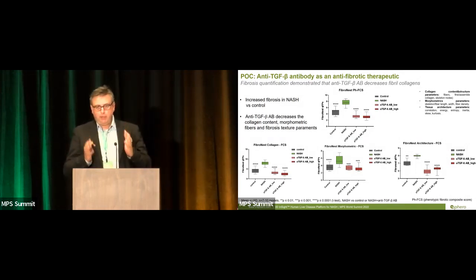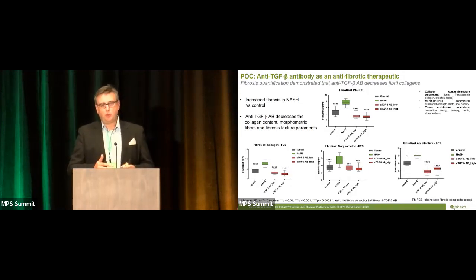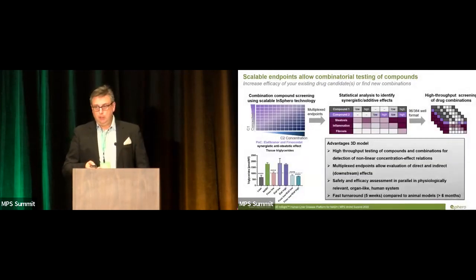The main focus on how we use this approach at the moment is that we are using different compounded indices that are basically drawing information from a selected subset of the 400 quantifiable fibrosis parameters and then give us a compounded score that is a figure of merit for us to decide, is this a drug that has an antifibrotic effect or not? And is that effect dose dependent, which are two key criteria for moving forward with the drug in the clinical trials.